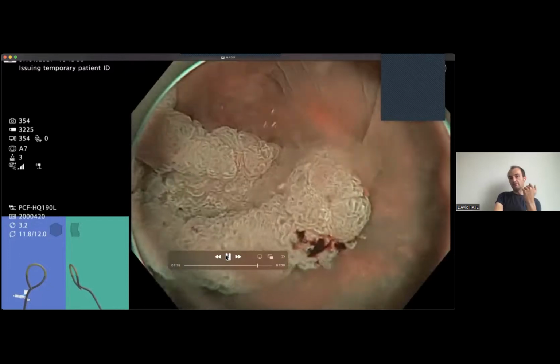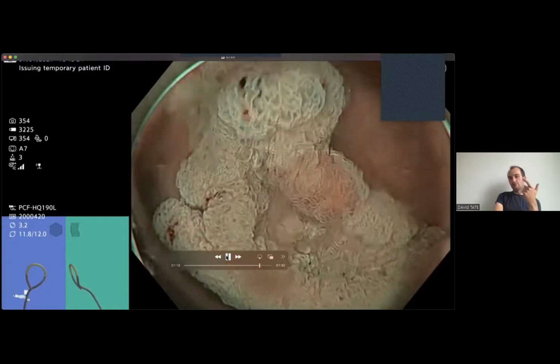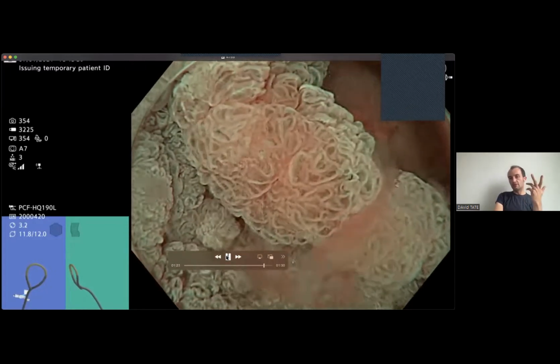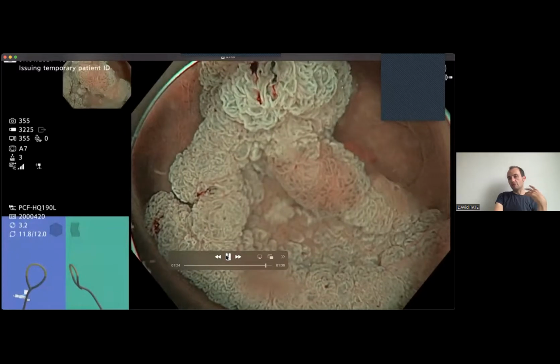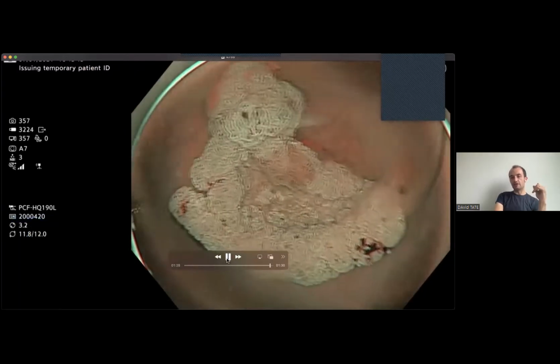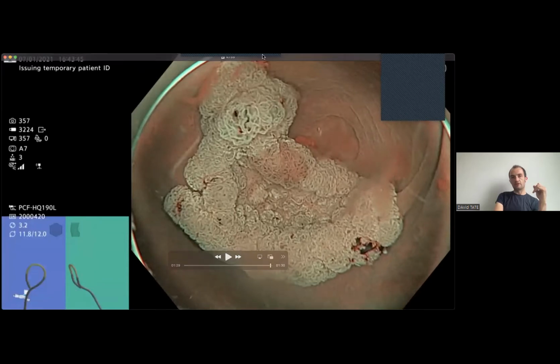So in this case, we have a granular, low risk, not so big, low risk, with a nodule, one high risk element, in the right colon, low risk. So it's probably 1 out of 4 low risk. So let's see what Vikash can come up with for this one first, and then we'll go back to the other one, Vikash, after that maybe.